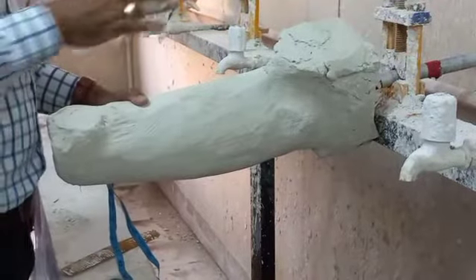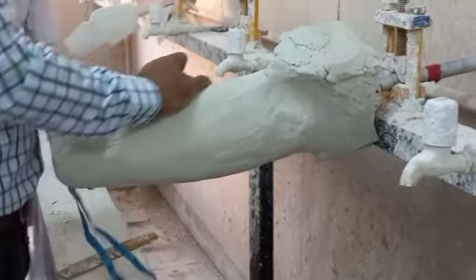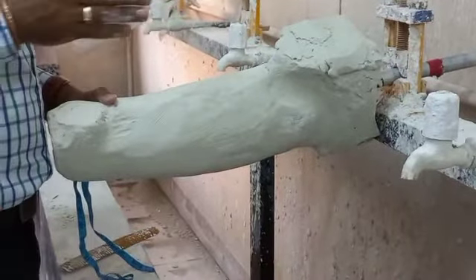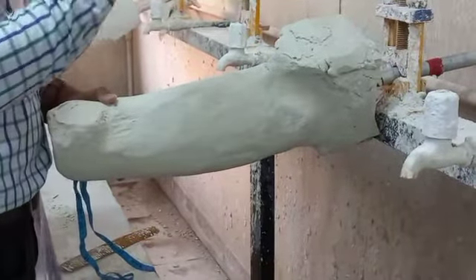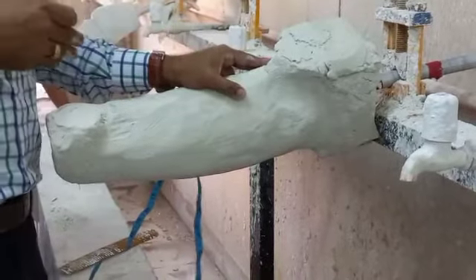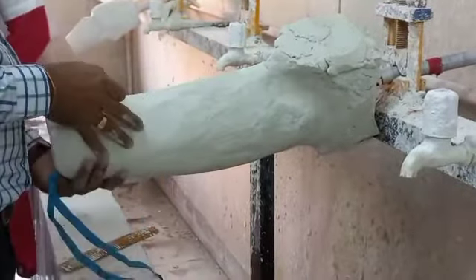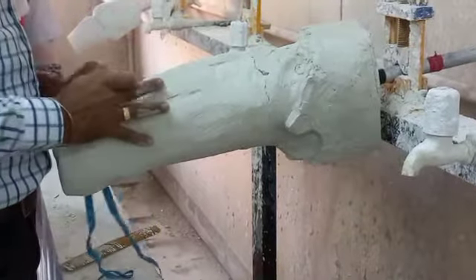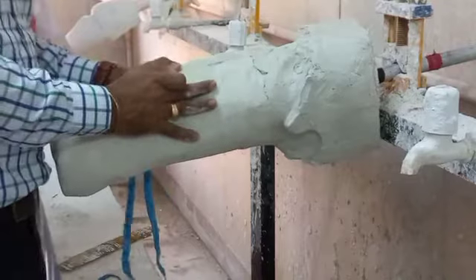Another important point, we are not going to disturb the shape as much as possible, because during modification we create certain loading and therefore we reshape the positive mold, but reshaping should be done to the minimum, because we will be disturbing the pressure distribution all over, right?